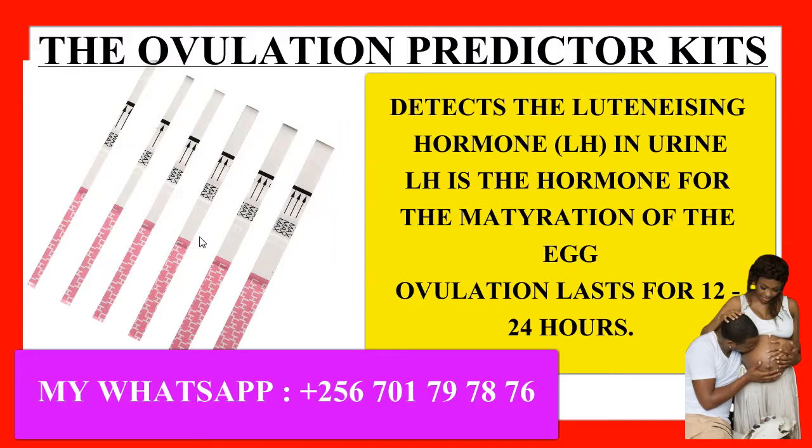That is when the level of LH, or maturation and ovulation, is really at its peak. Since sperm stays in a woman's system for at least 3 to 5 days, and the egg is released for only 12 to 24 hours, we recommend you have sex 2 days and up to the following days leading to the ovulation date.